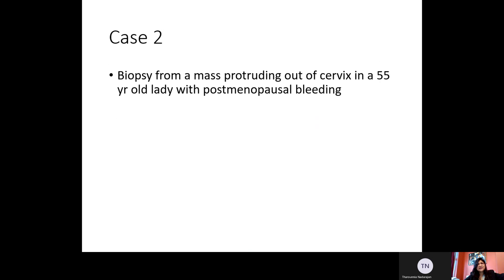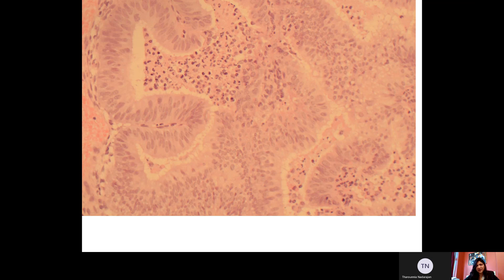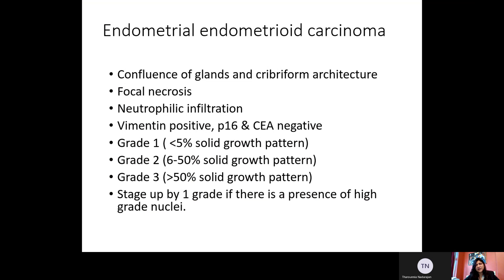Our second case is a biopsy from a mass protruding out of the cervix in a 55-year-old lady with postmenopausal bleeding. In this view, we can see a glandular tumor with confluence of some glands. There is stroma between some glands, but there is confluence in this area. We can see neutrophilic infiltration and necrosis, and the nuclei are high-grade with some showing prominent nucleoli. This was diagnosed as grade 2 endometrioid adenocarcinoma after confirming with immunostains.